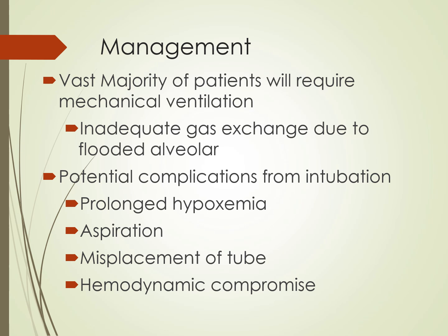There are some potential complications from intubation. Sometimes it takes a long time to intubate someone, and this creates a prolonged hypoxemic effect on the patient. Some patients aspirate gastric content when they're intubated. Some patients have a misplacement of the ET tube. It doesn't go down the trachea, it goes down the stomach.